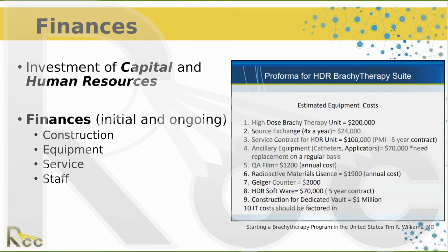It would be something worth investigating. I would hope there might be some publications about that. I think there are reasons we do the flat tabletop in terms of reproducibility and setting the patient up. I don't know that it's as easy to place the patient in the same position on a curved tabletop as it is on a flat tabletop.